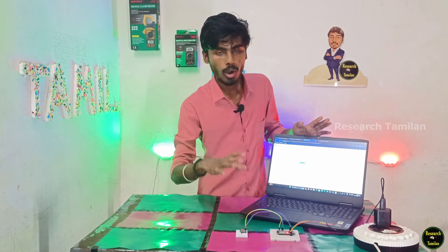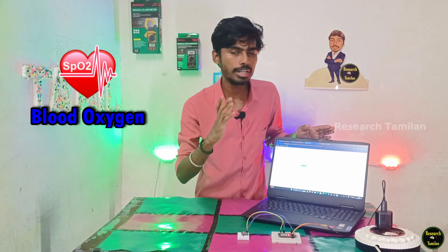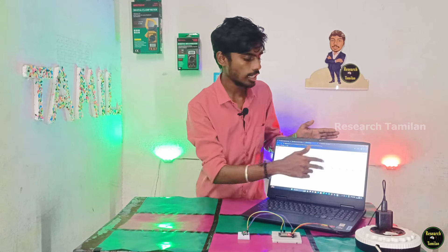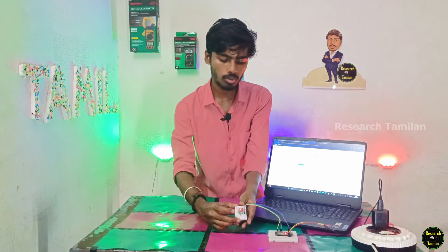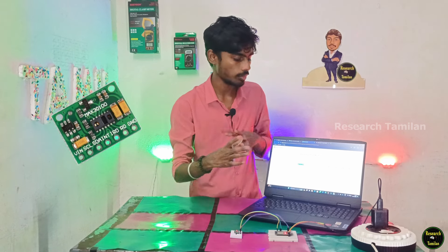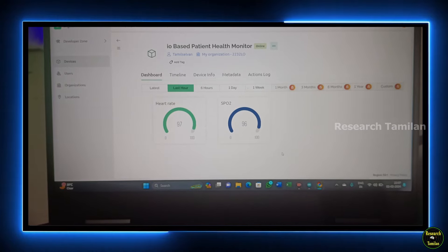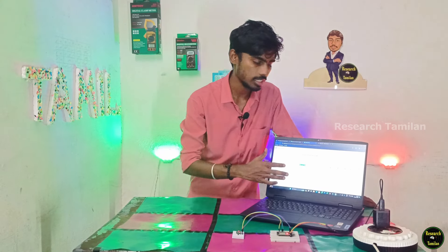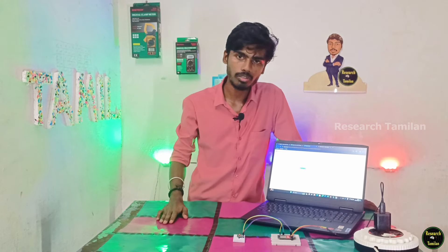This video is about a patient heart rate and blood oxygen level. If you have a sensor, you can measure and send data to a Blynk server. If you have a patient, you can monitor a heart rate. If you have a Blynk server, you can start the video. So let's start.